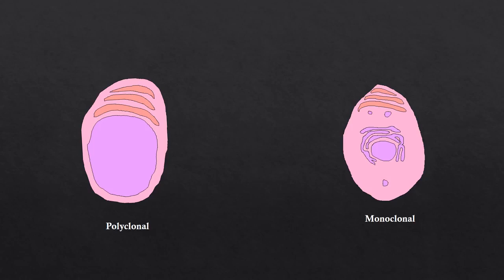Monoclonal antibodies are useful for finding proteins with consistency over a long period of time. This allows researchers to study one protein over multiple batches of the serum. In contrast, polyclonal antibodies can vary. However, polyclonal antibodies are more likely to actually show the stain because more antibodies attach to the protein. Therefore, the use of monoclonal or polyclonal antibodies is determined on a case-by-case basis, depending on the protein, the tissue sample, the conditions, and the number of epitopes involved.